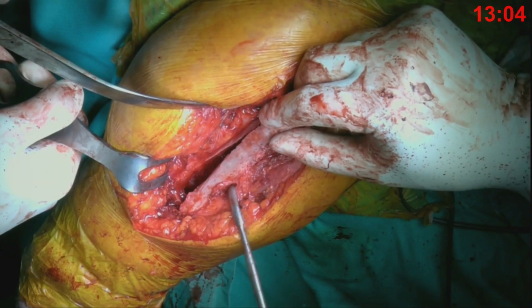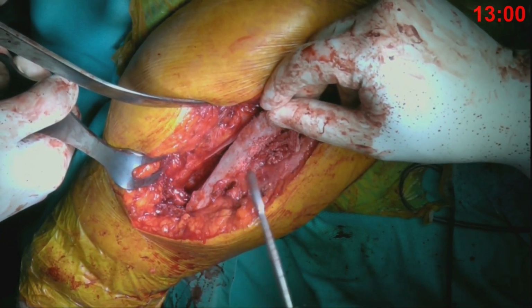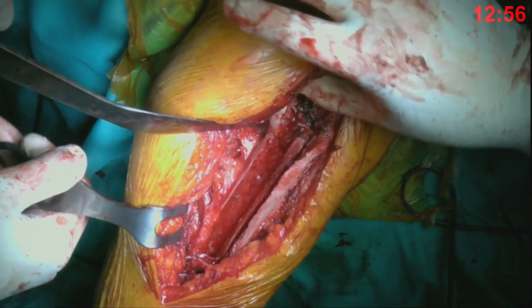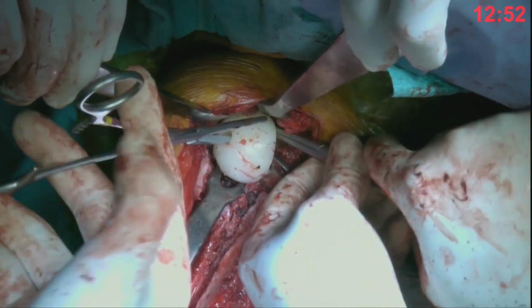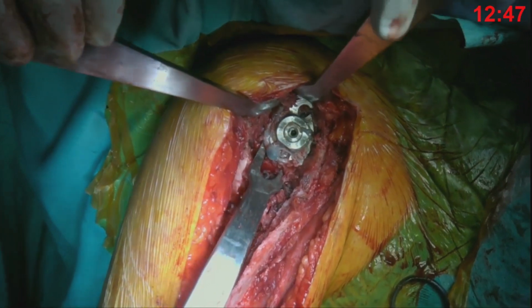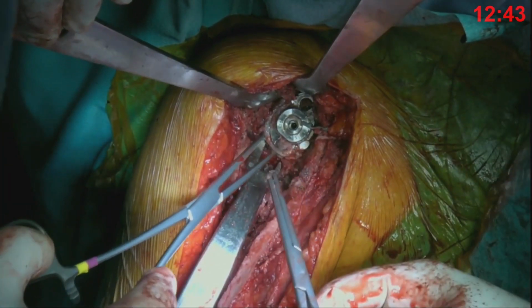So after fighting a little, we remove the stem. So now we go, just to respect the pectoralis major, as was said, it is very, very important. And then we go proximally. We remove the glenosphere. And we found what we expected. This is the base plate removal.